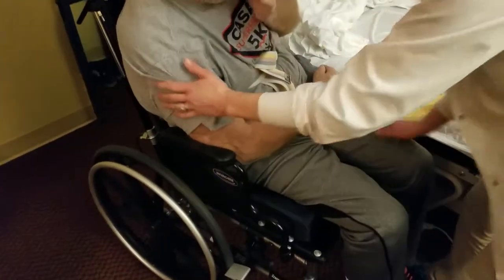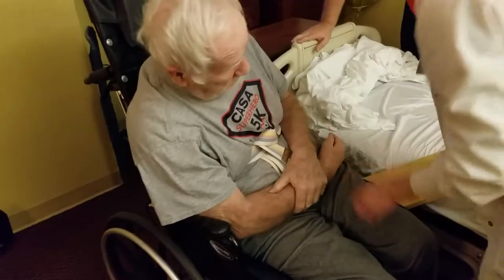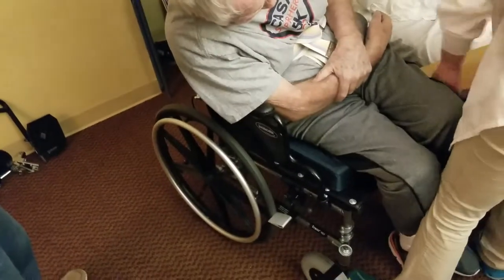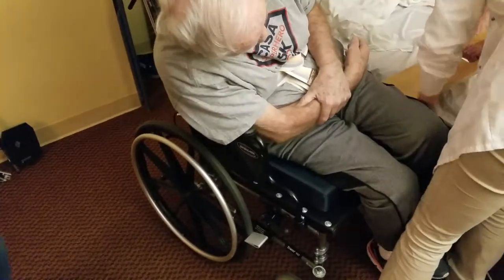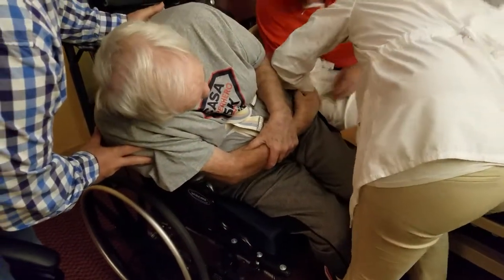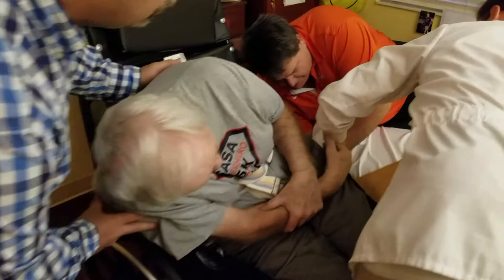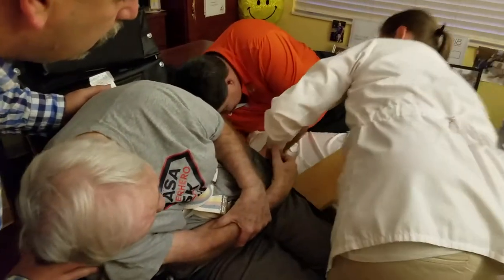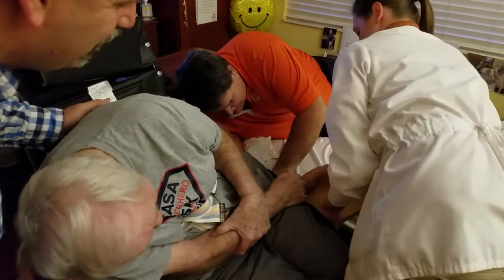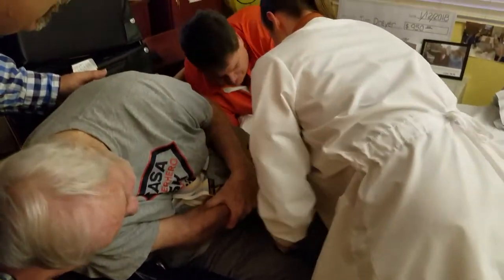Once he's in the chair, have him lean that way and pull the board out. Whoops — it got stuck on that pad. I should have taken that out. That sticky red pad — if it were me I would take that out beforehand. I didn't even think of it.